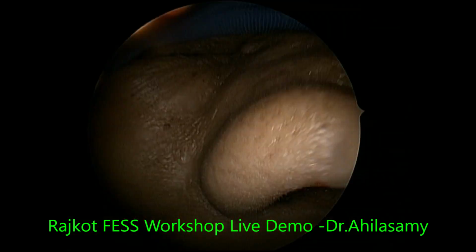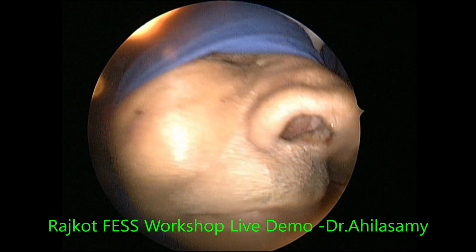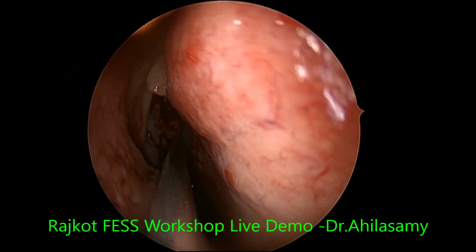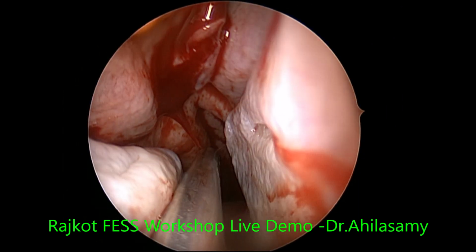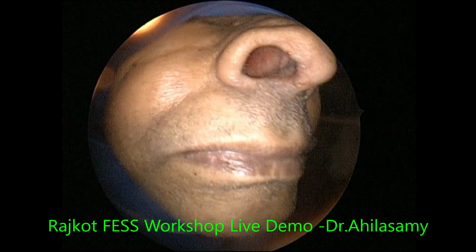It's a luxury to do any nose and sinus surgery under local anesthesia. You can appreciate the field when I operate. Hardly there will be any bleeding, it will be very dry. Little blood that goes down is sucked out, or ask the patient to swallow it.